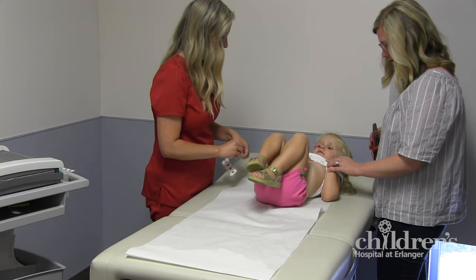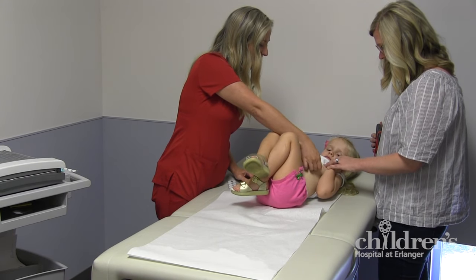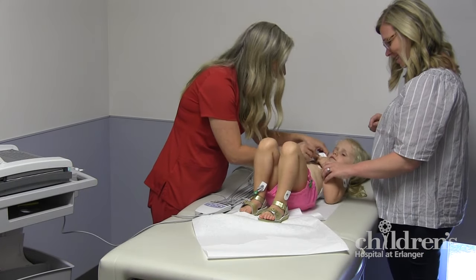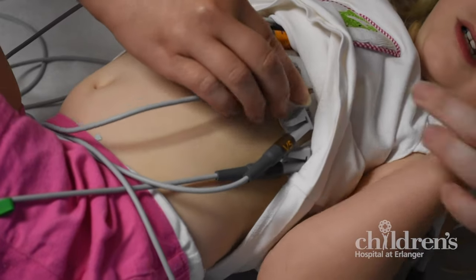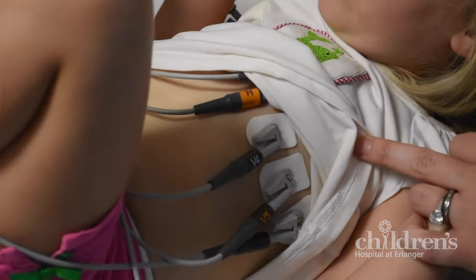The electrodes are like little feelers that sense the electrical signals in your body. You can't feel them, but they can feel the electricity in your body. We then clip wires called leads to each electrode. These wires go to our EKG machine.